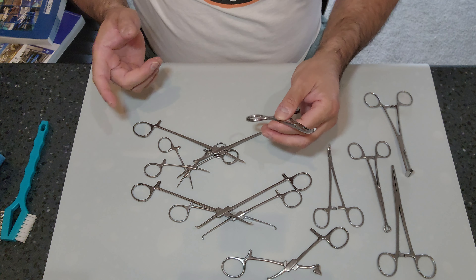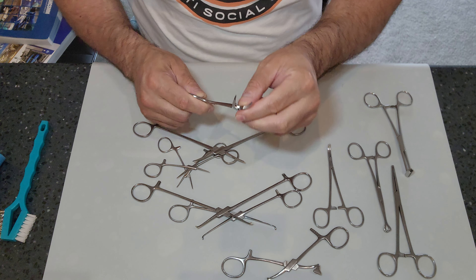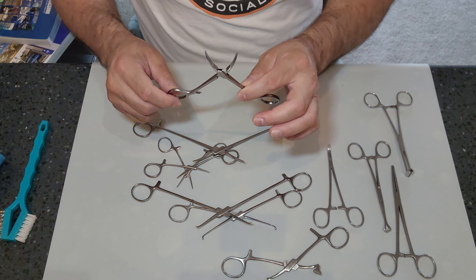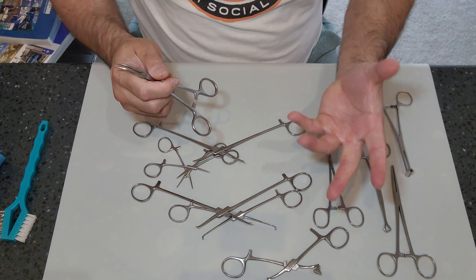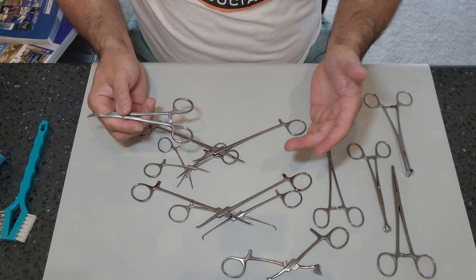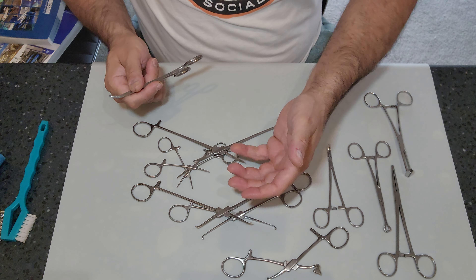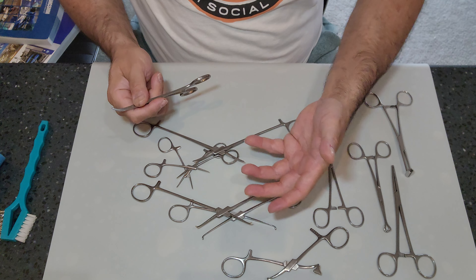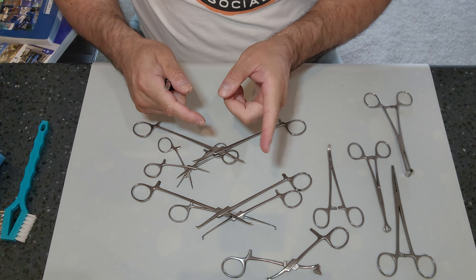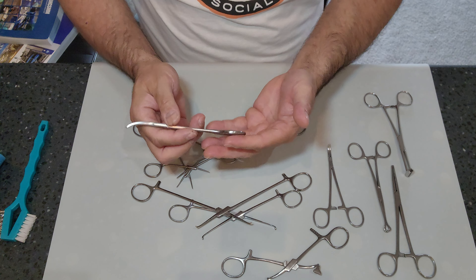A quick note on the anatomy of clamped instruments: it is important that we concentrate on the working end — the jaw — and the box lock. Those are the areas usually covered in gross soil. Yes, there will be blood on the handles too, because oftentimes surgeons or scrub techs are asked to retract or hold a specific area of the anatomy to assist in surgery. Surgeons like to dissect with their fingers, so you will see blood on the handles as well.